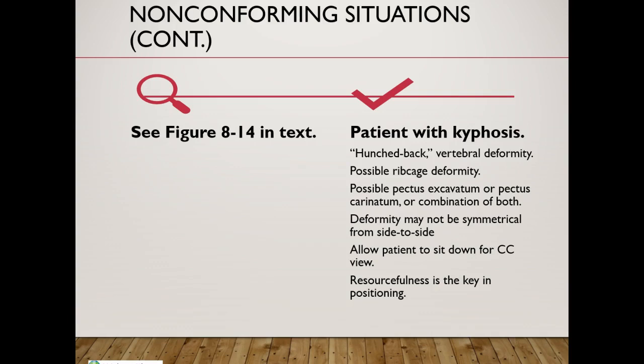And another thing to keep in mind is once you get the patient positioned and you start compressing, that's when you know if it's working or not. You can let it off, make your adjustments, give another go at it after you've made your adjustments, and now things may be moving more in the direction that you want them to.